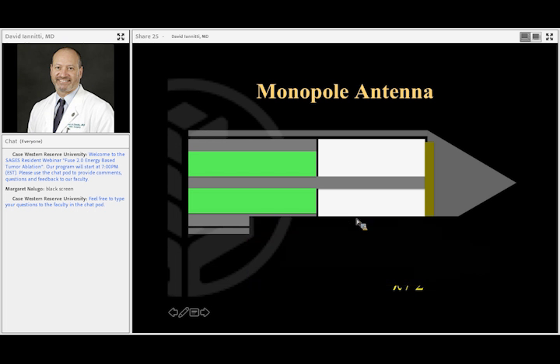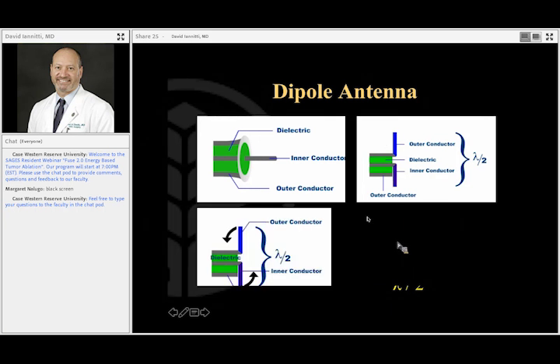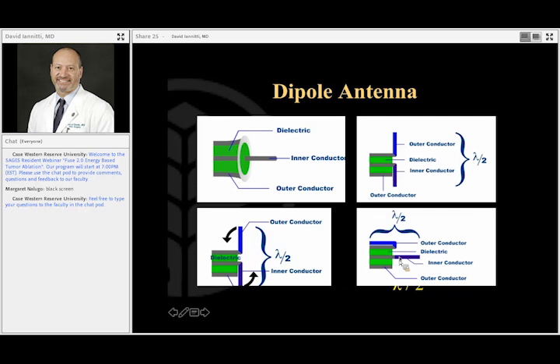Then you have a dipole antenna, a little bit more complicated, but not really. So basically what you do is you strip off, rather than a half a wavelength, a quarter of a wavelength of the inner conductor, as well as extend the outer conductor another quarter of a wavelength. And if you line these up perpendicular to the cable, then you're at half a wavelength. Now, this would be an end fire, which we don't use. So you can just rotate these back, and now you have a quarter of a wavelength of the outer conductor, a quarter of a wavelength of the inner conductor, and this gives you half a wavelength. And that's what a dipole antenna looks like.